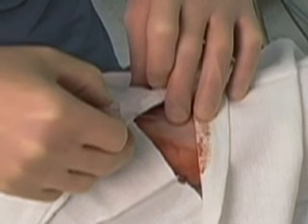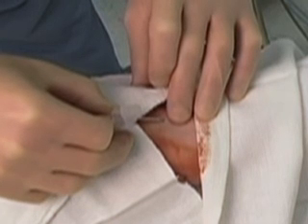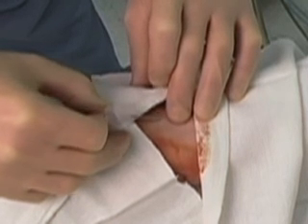In some instances, the catheter may get hung up on the skin, making it hard to advance. The risk of this can be minimized at the start of the procedure by making a skin nick using either an 11-blade scalpel or a larger bore needle.